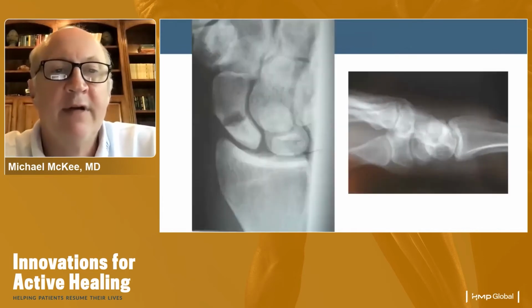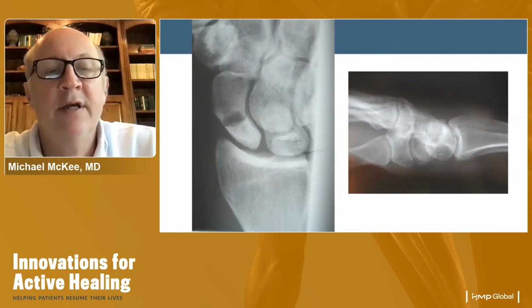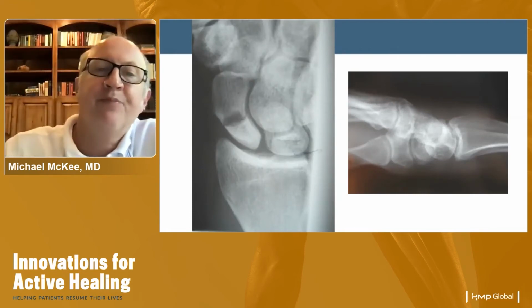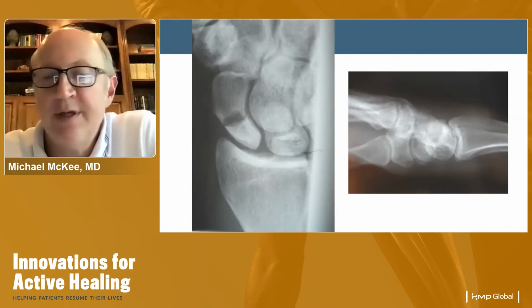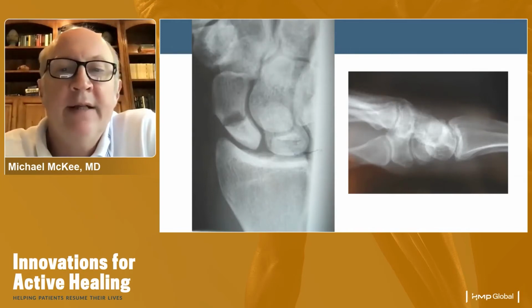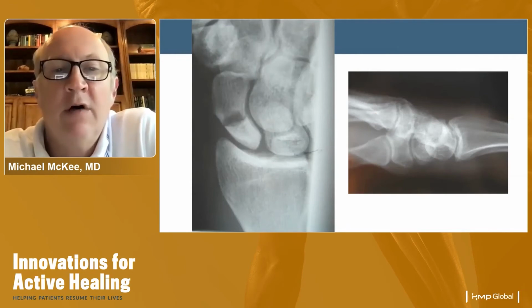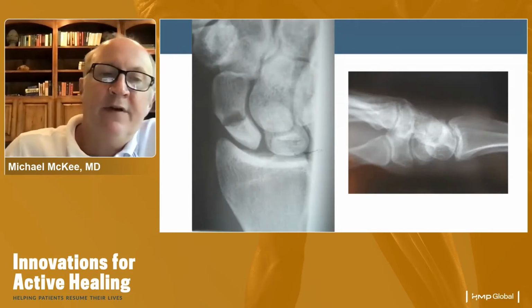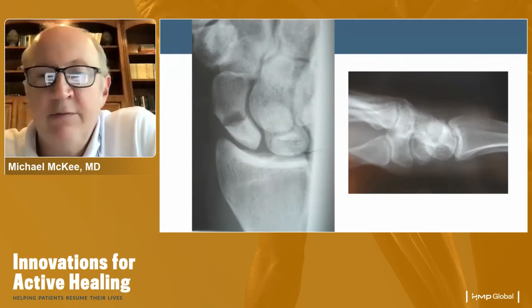And those are his radiographs here. And you can see there's, again, significant degeneration at the fracture site with cystic formation. You can see a fairly sclerotic looking proximal pole. And if you look at the lateral, you can also see he's developing some carpal instability pattern with a scapholunate angle, which is obviously off. And this can happen with the progression of time in these individuals, which certainly does affect wrist function as well.